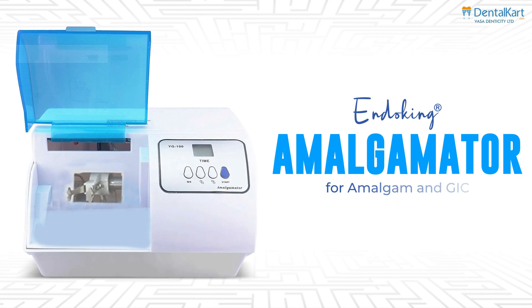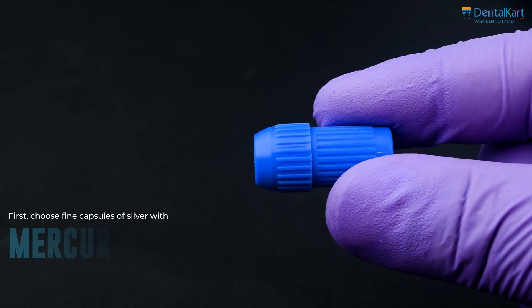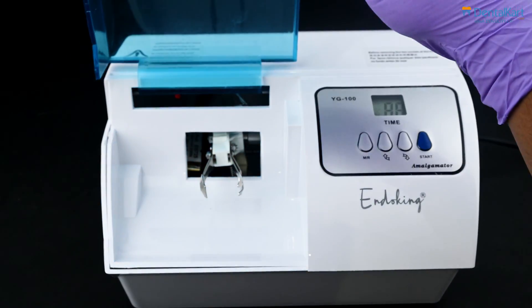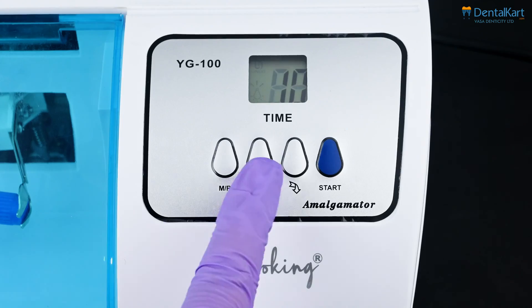Now, let's see the Endoking Amalgamator in action. First, choose fine capsules of silver with mercury or GIC capsules. Open the transparent protective cover and fix the capsule on the holder of the mixer. Then close the cover.